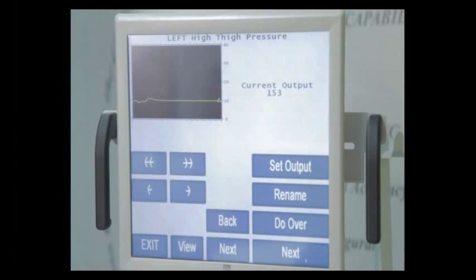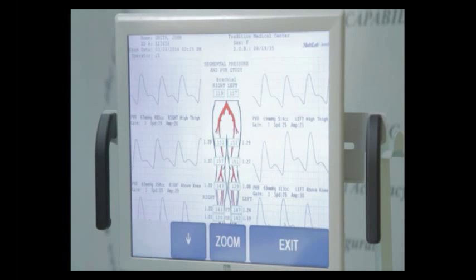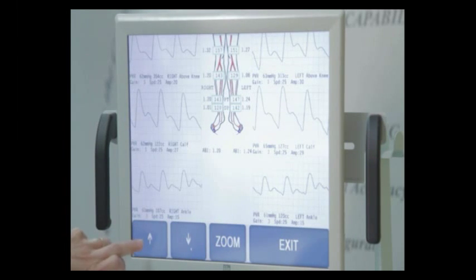What we're going to do now is print the exam and send it to PACS. So when you're finished, you can simply press Exit and View. I like to view my study before I let my patient go to see if there's anything I want to change. So looking at the screen here, my waveforms look good. All very nice left to right, profoundly normal study.